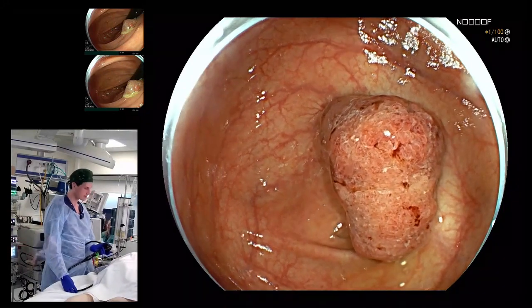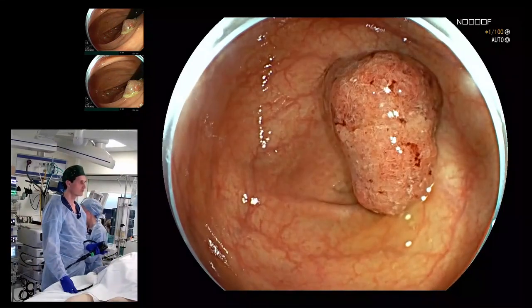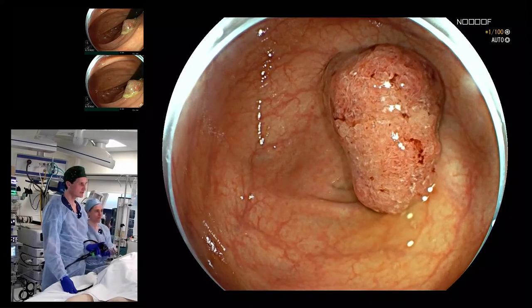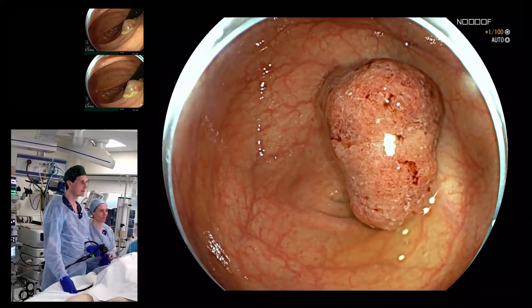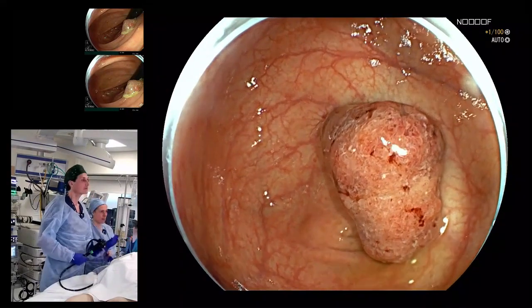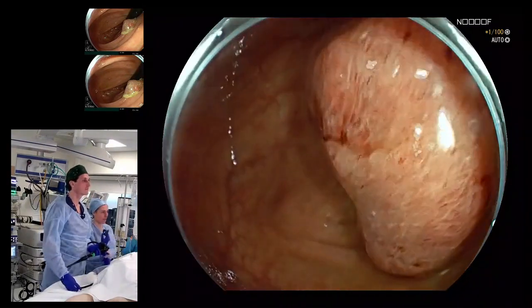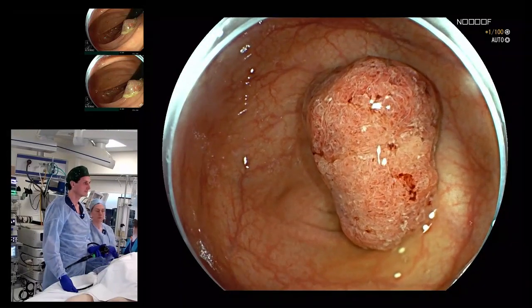Please read off the side of the instrument what it is. Yeah, what model is it? We switched to the Fujifilm, the 760Z, long, with zoom function. Nice. Beautiful image.